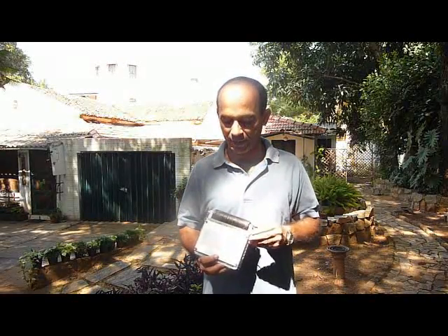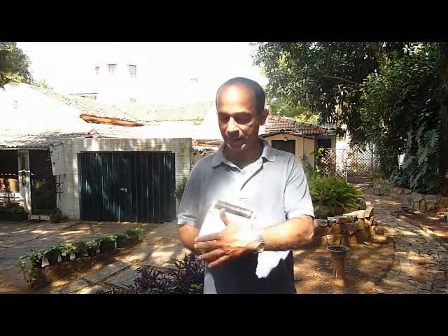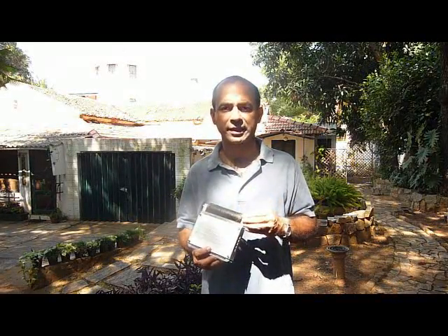Hello, I'm Paul, and I'm going to explain this mechanical Braille display device that I've made. It's basically what you can see. All the interesting stuff takes place under the plate, so I'm going to dismantle that, and hopefully you'll be able to see and understand exactly how each component works.